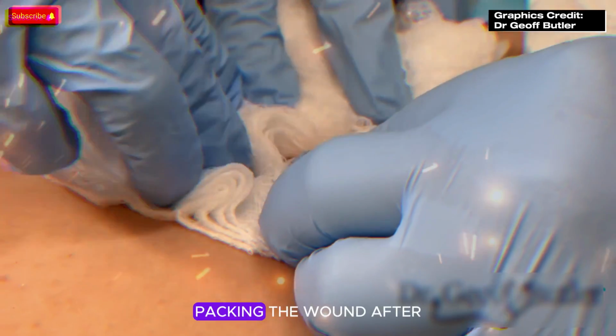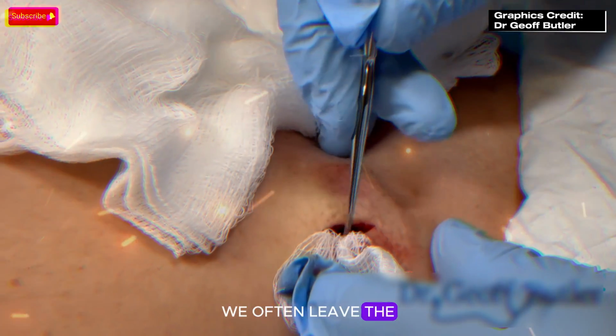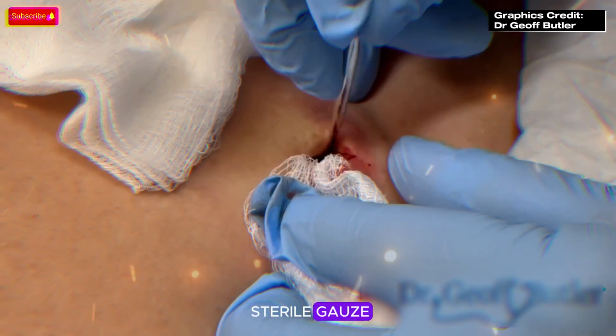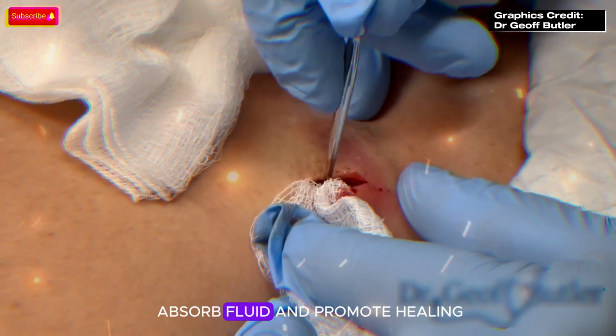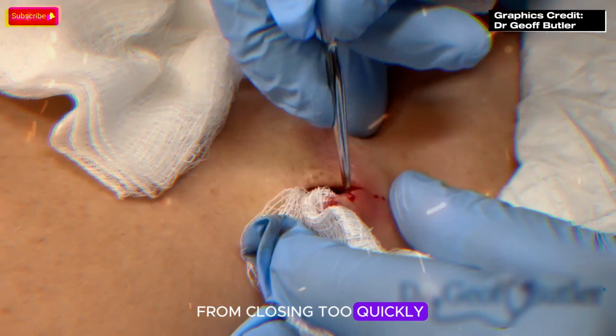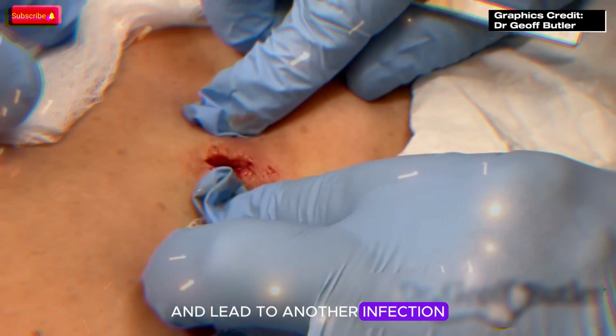Step 4. Packing the wound. After draining the cyst, we often leave the wound open to continue draining. A small piece of sterile gauze, called a wound packing strip, may be inserted to absorb fluid and promote healing. This prevents the cyst from closing too quickly, which could trap bacteria inside and lead to another infection.